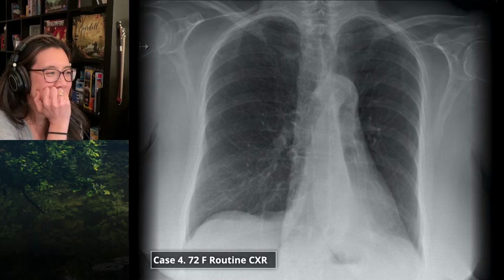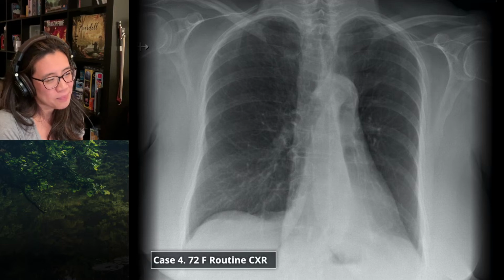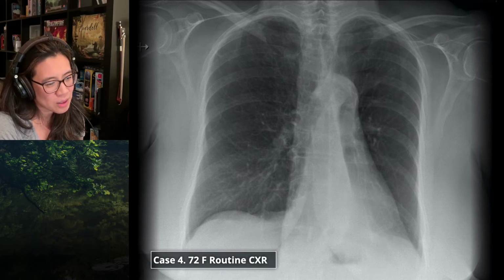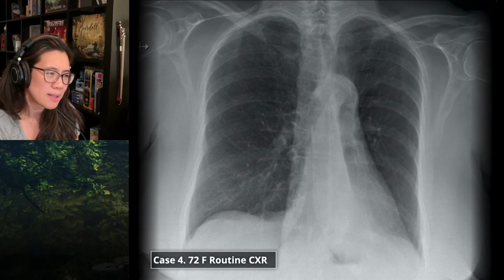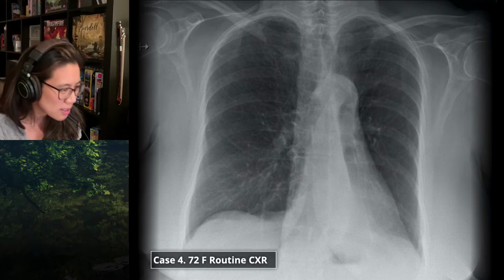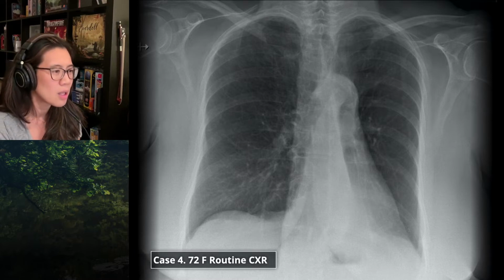Sorry, it's been unchanged for 4 years. Unchanged for 4 years, okay. PET scan she had for another reason showed no abnormality there. So what sort of things would you be thinking about now? Well, so is there something in the mediastinum? Well, the thing that perplexes me is that you're saying that there's no lung abnormality on a previous CT chest, so this isn't left. No, it looks identical to this.